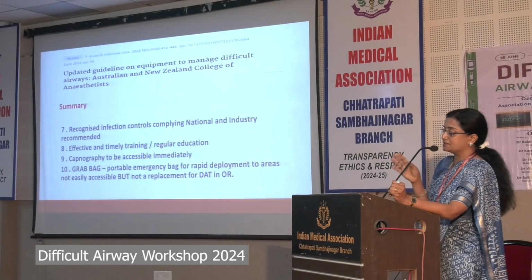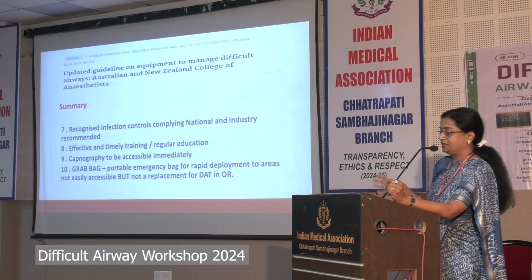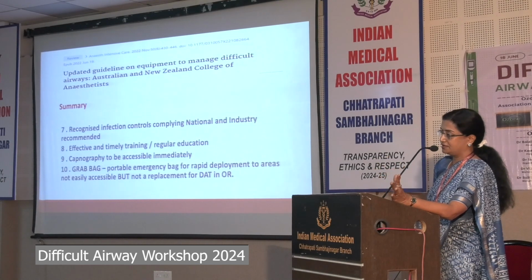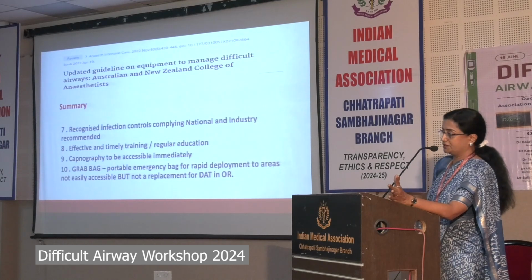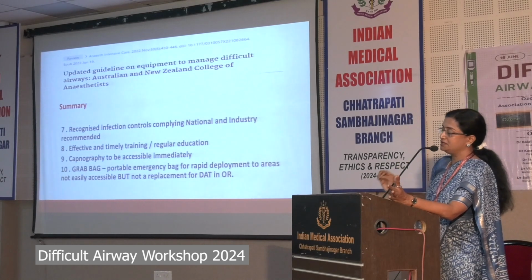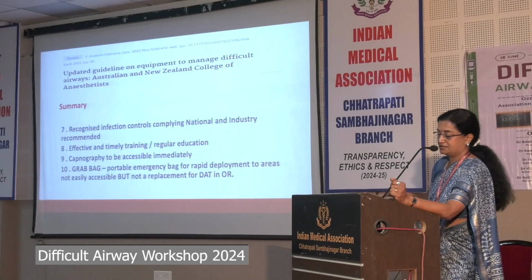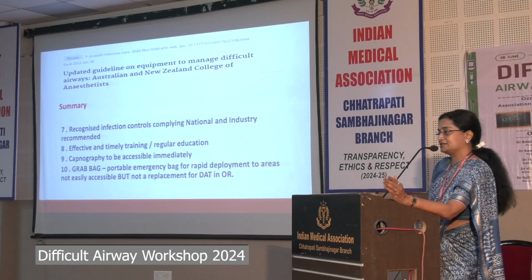Recognized infection control, complying with national and industry recommended protocols, should be followed. Effective and timely training or regular education such as these workshops should be regularly attended. Capnography is mandatory and should be immediately accessible to any corner of the hospital where a difficult airway intubation is being conducted.